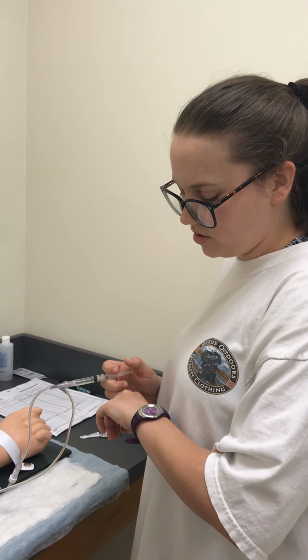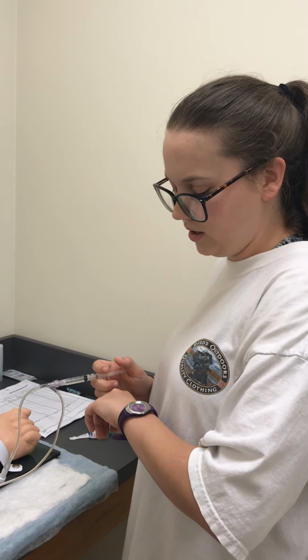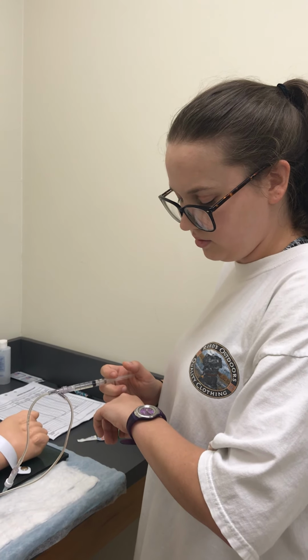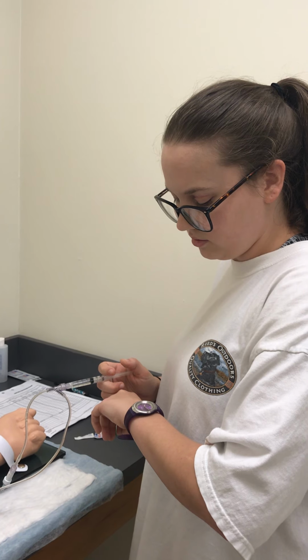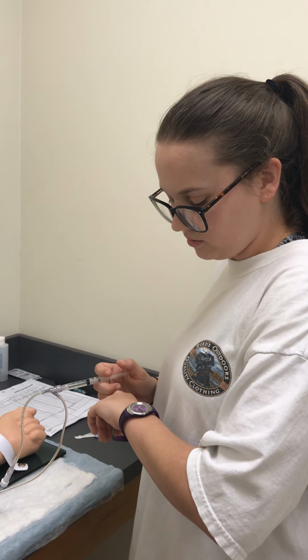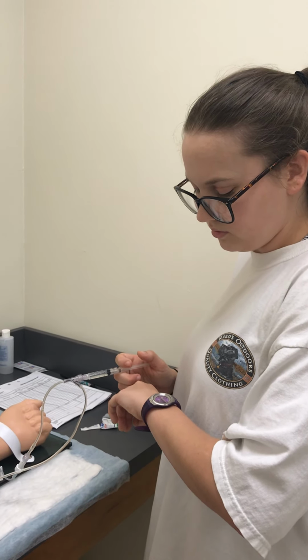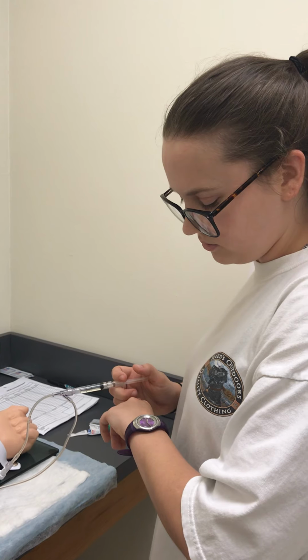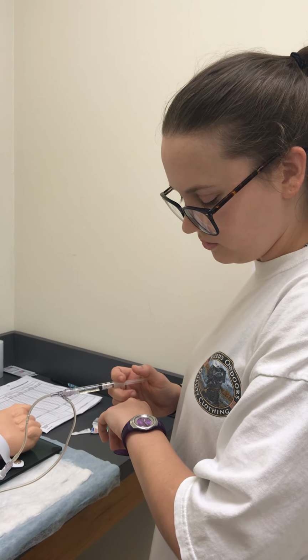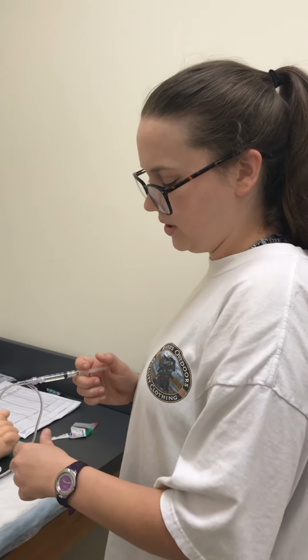I'm going to tell my patient to report any tarry stools, any weight gain or edema after the administration. Okay, full minute has passed.